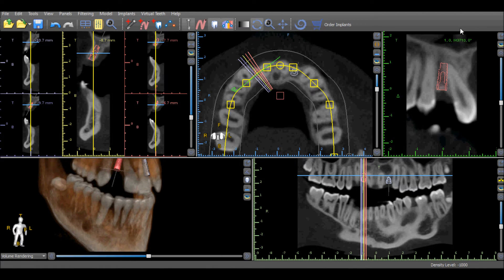The tangential view in the top right corner can be used to see 360 degrees around the dental implant or around any element of the patient's anatomy.